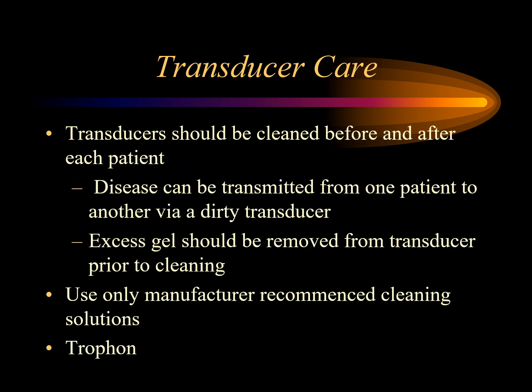Transducers should be cleaned before and after each patient. Disease can easily be transmitted from one patient to another if the transducer isn't clean and it's left dirty. Excess gel should be removed from the transducer prior to cleaning, and then you'll use a manufacturer recommended cleaning solution. This is typically in the form of a wipe or a spray that you're going to use to clean the transducer and disinfect it.